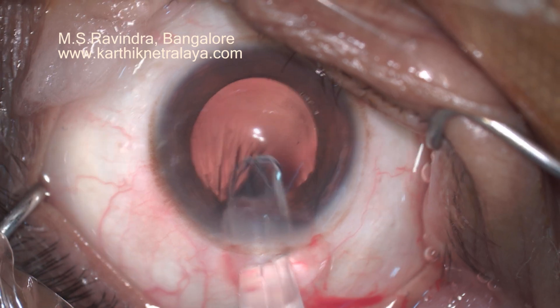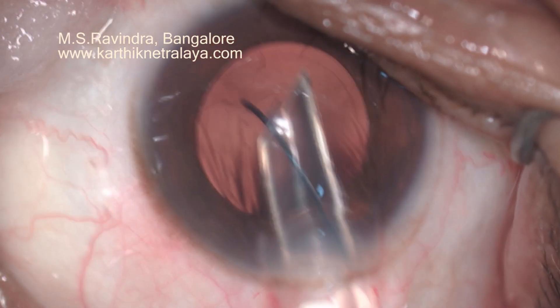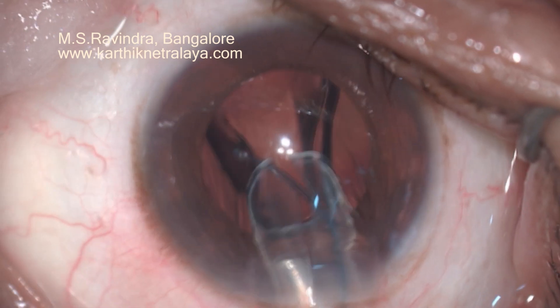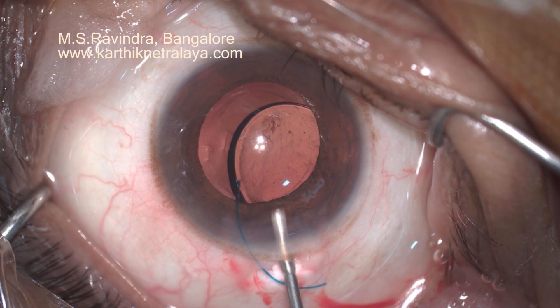Pronate the wrist fully and then slowly supinate, as you can see here. The haptic comes out in its normal configuration and does not have to somersault inside the eye. Ensure that the tip of it does not poke the posterior capsule.